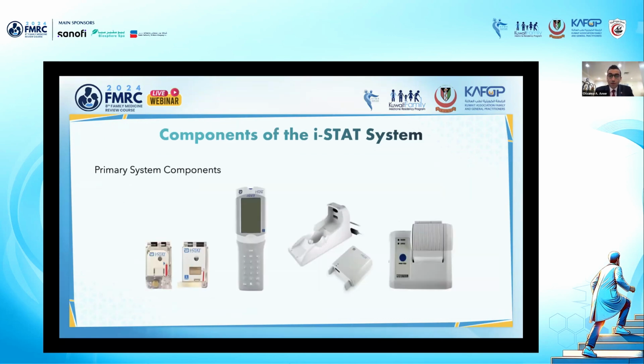First, we'll talk about the components of the iSTAT system. The first one is the cartridge. It's the brain of the iSTAT system, and I will tell you later why. The second part is the iSTAT device. It's a small, handheld one. And the third part is the downloader.